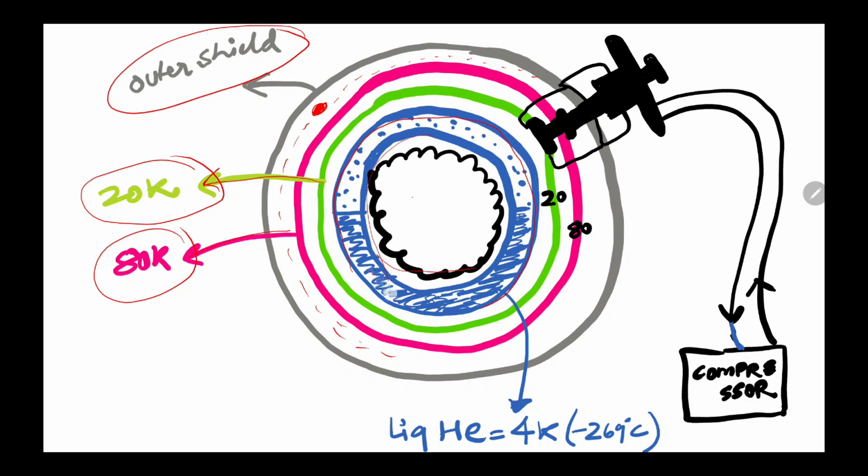So in this helium chamber, some liquid quantity will be there, some gaseous clouds are there, and the innermost will be the magnet. I am trying to project in this diagram that this black color magnet coil is dipped in the liquid helium. I'll show you one good diagram downloaded from the internet. Just focus on this one. So this black color is a magnet diagram.